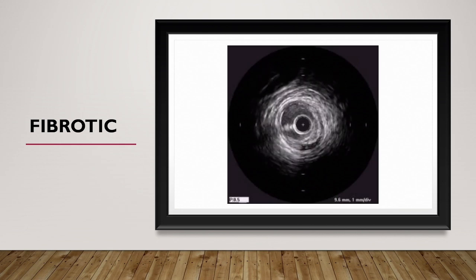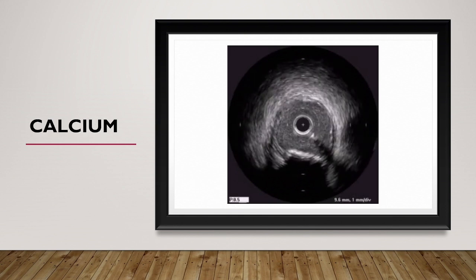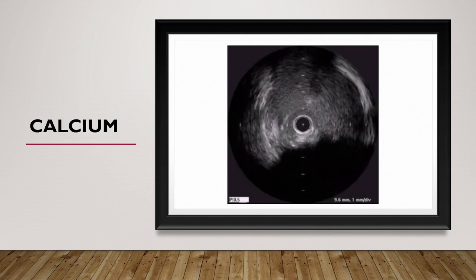And fibrotic tissue you have to identify, because stent under expansion can be a problem. You have to modify, not by a rota or an IVL, but at least you can use a high pressure NC balloon in such cases, or a cutting balloon, to modify the lesion before opening your stent. So fibrotic lesions are sometimes troublesome, so you have to prepare accordingly.